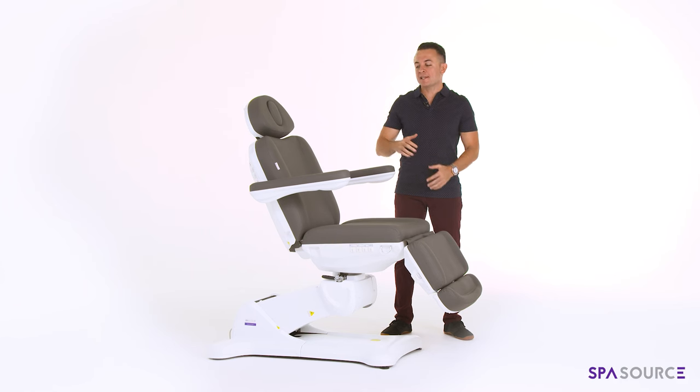Lastly, please remember that the chair comes in the colors of gray — as you can see in the video — all black, sand top, white top, and black top. If you have any questions, feel free to reach out.